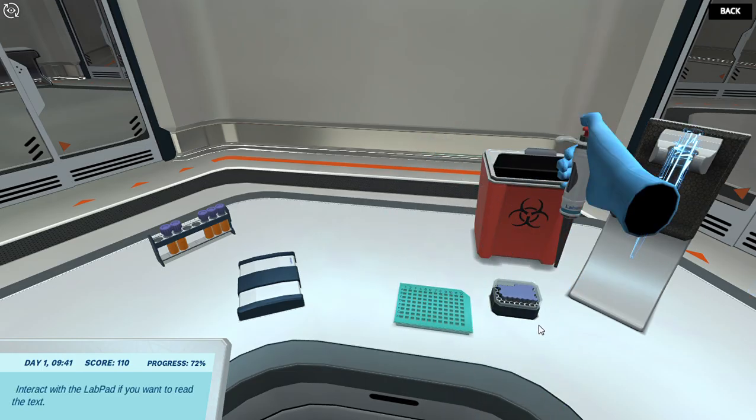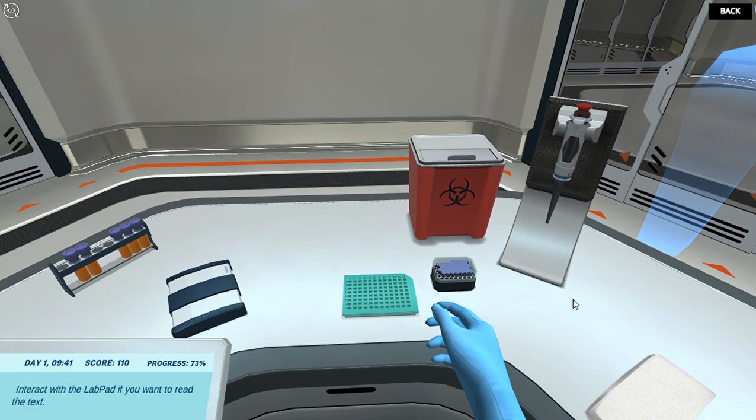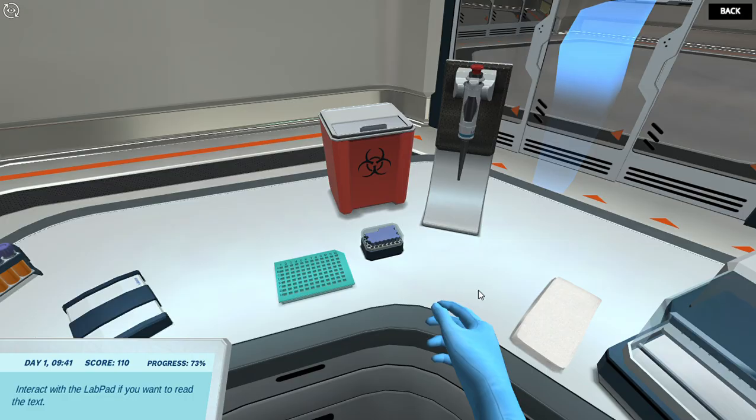Let me do my part now and fill the wells across the plate. Now that we have all the samples in place, we'll need to incubate and wash just like we did for the primary. This gives the epitope on the serum IgM and IgG time to bind to the respective capture antibodies on the base of the plate.